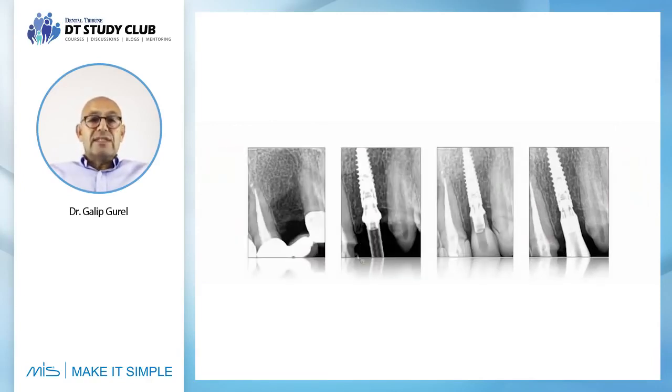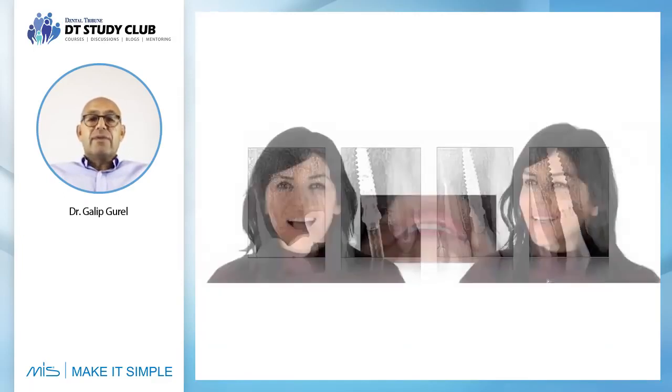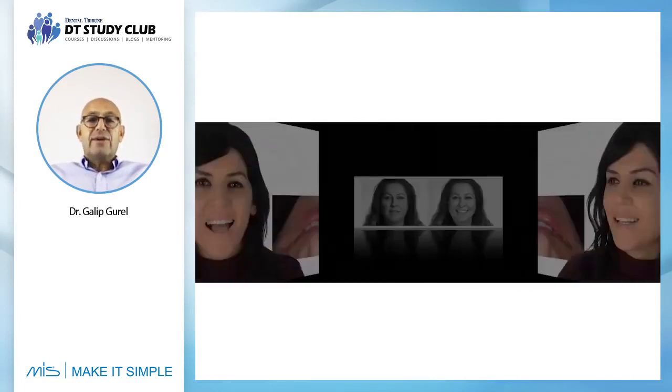So this is all the steps with the X-ray, the beginning, the connect, provisional on top of the connect, and the final veneer, final crown on top of that. And when you look at the arch position, everything is perfectly balanced, and I think a happy patient after all.